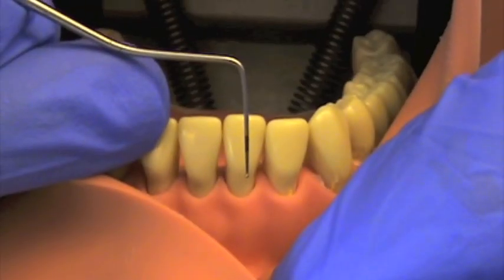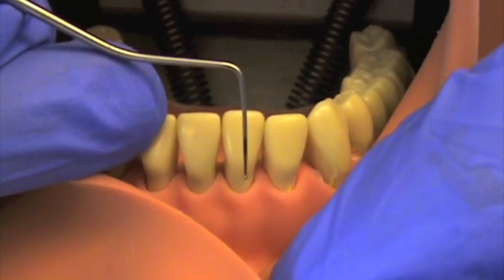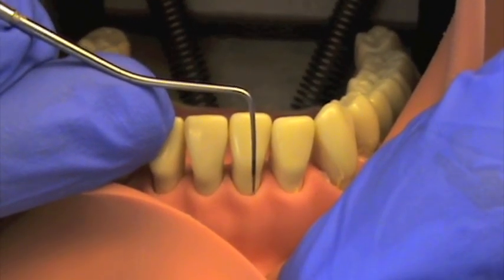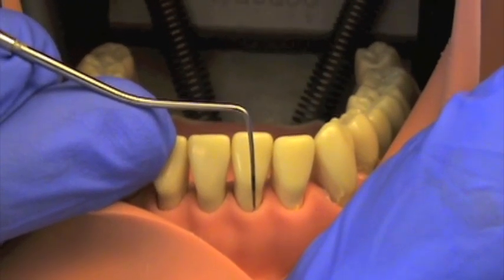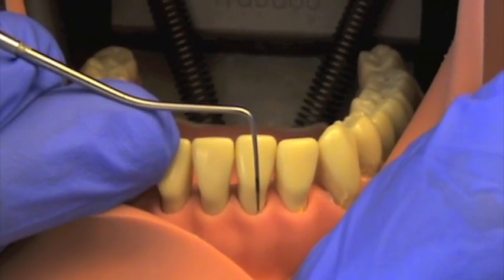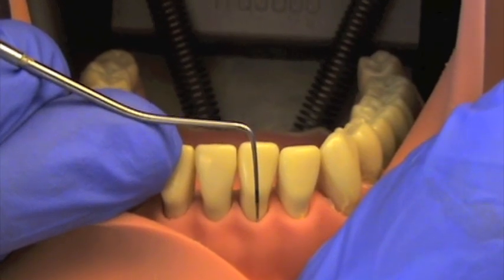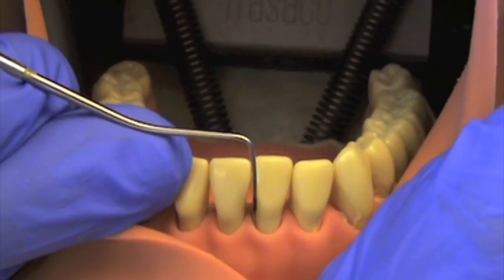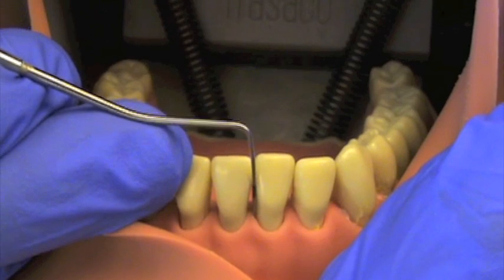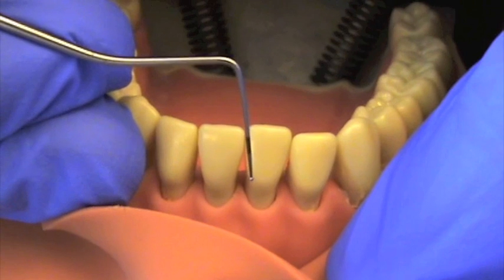To perform a BPE, you need to insert the probe into the gingival sulcus, down the long axis of the tooth, with about 20 to 25 grams of pressure. You then walk the probe around the tooth with the same amount of pressure. The BPE examination is recorded as codes.